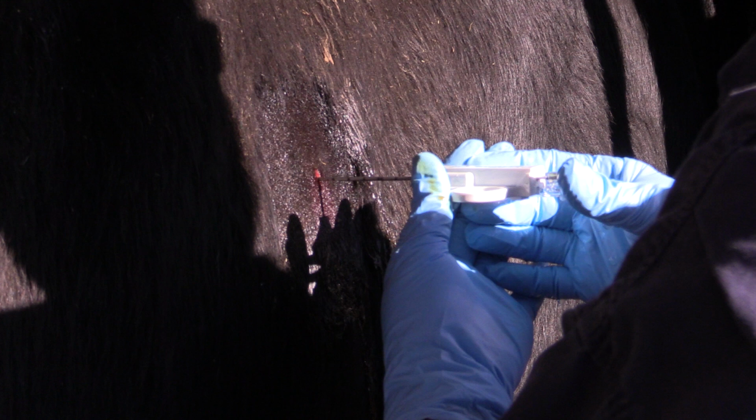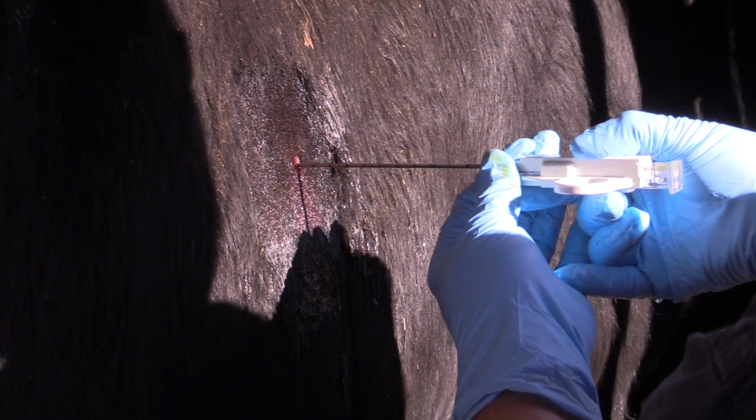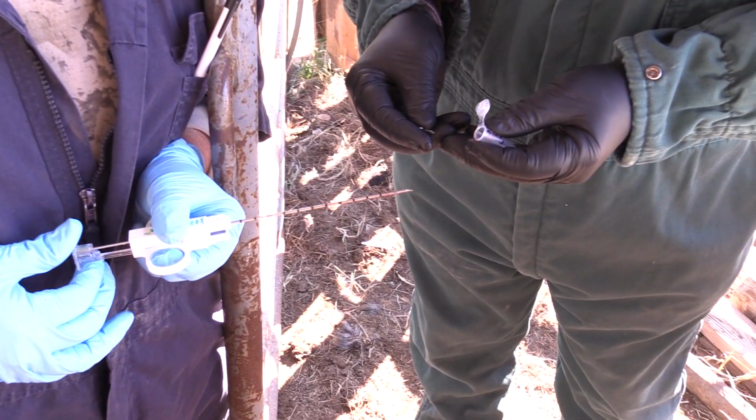Do not push it all the way. Push the trigger of the biopsy needle forward until a click is heard. The outside cutting portion will slide over the notch, collecting the liver. Quickly retract the biopsy needle. Once the biopsy needle is fully removed, pull back the spring-loaded handle until a click is heard.